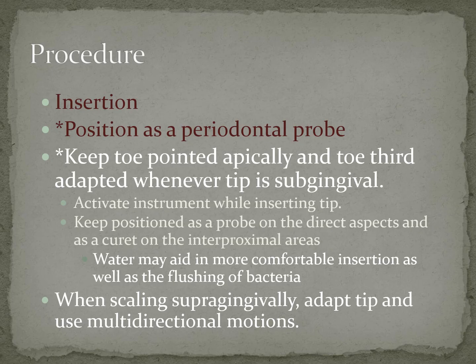So you'll also hear me say tap, tap, sweep, tap, tap, sweep. That is, you're going to be tapping it subgingivally and sweeping to the next area. You're just going to keep moving, keep moving, keep moving. The water may aid in more comfortable insertion as well as flushing out that bacteria. Okay, so when scaling supragingivally, you're going to adapt that tip and use multi-directional strokes. It's not going to be as specific as when you're subgingival, because obviously we can't see where we're at. Supragingival, you can. So you're just going to move that around constantly.